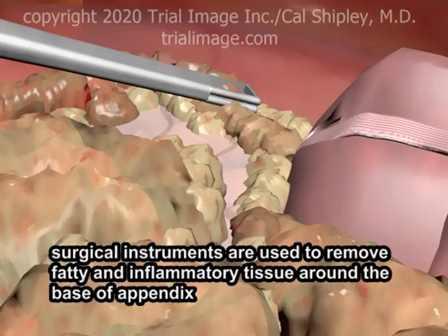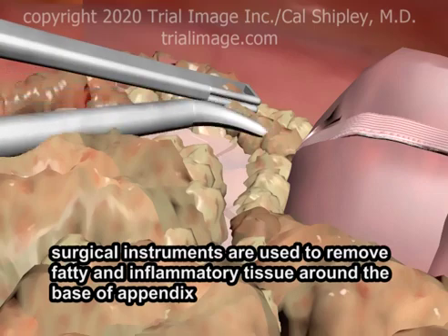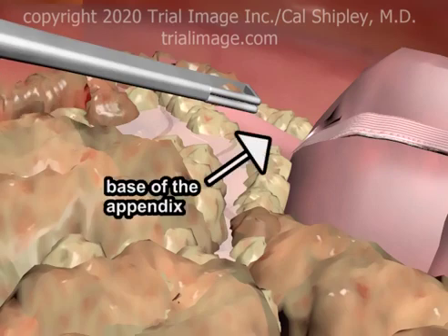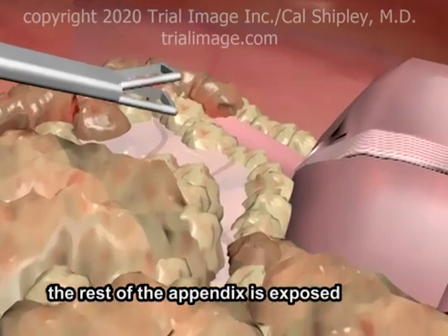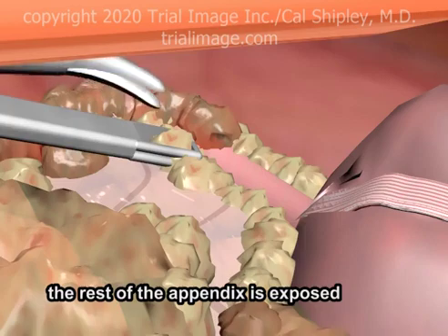Surgical instruments are used to remove fatty and inflammatory tissue around the base of the appendix. Once the base of the appendix has been exposed, the surgeon systematically exposes the rest of the organ to its tip.